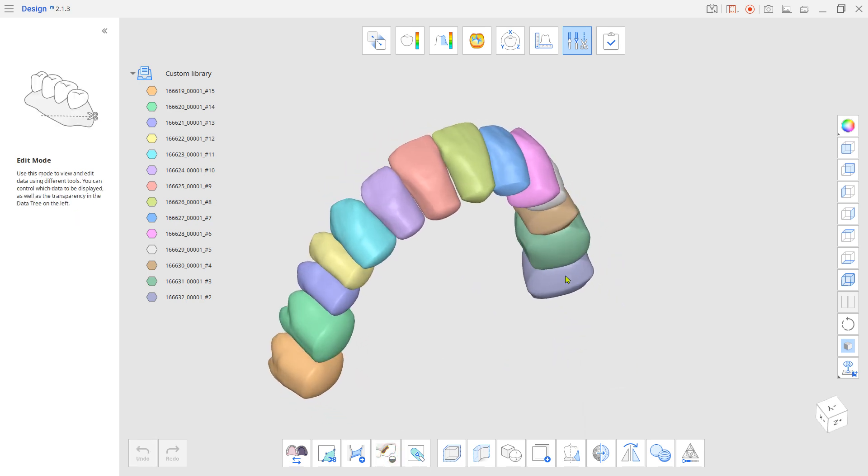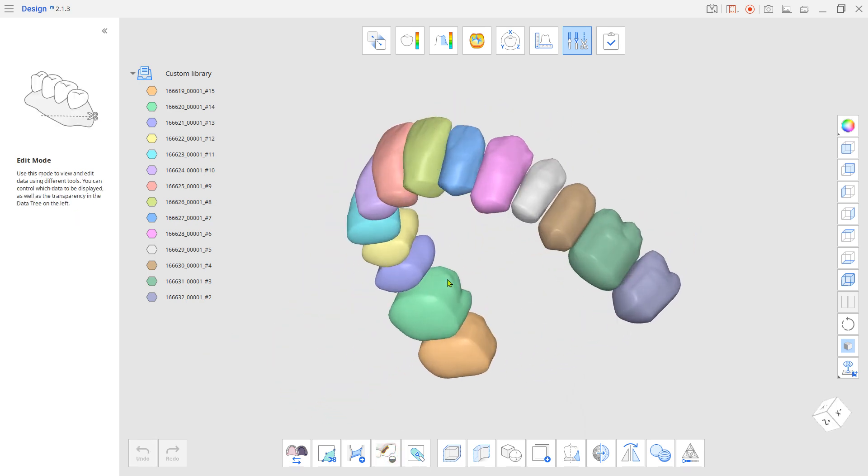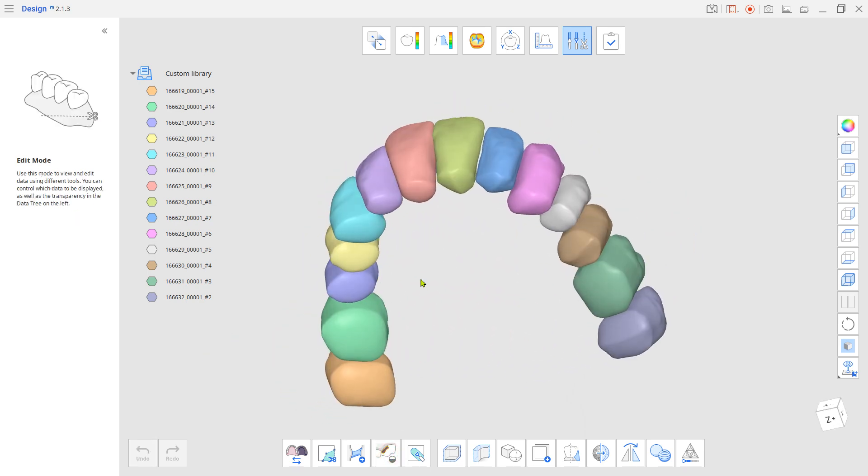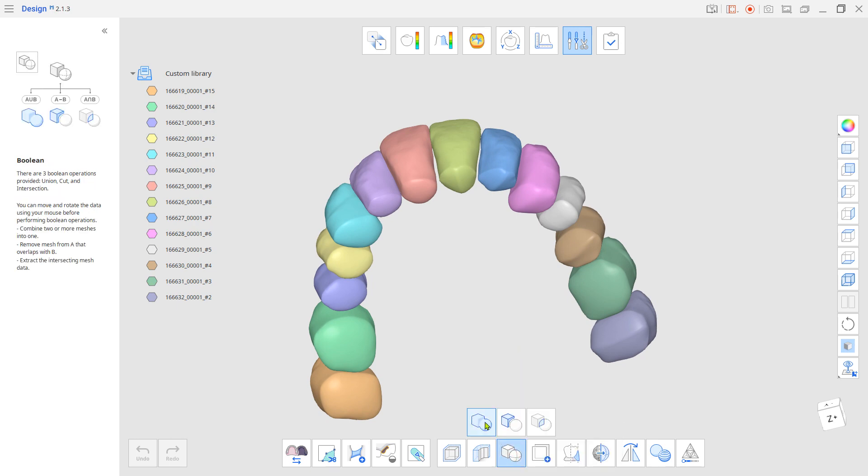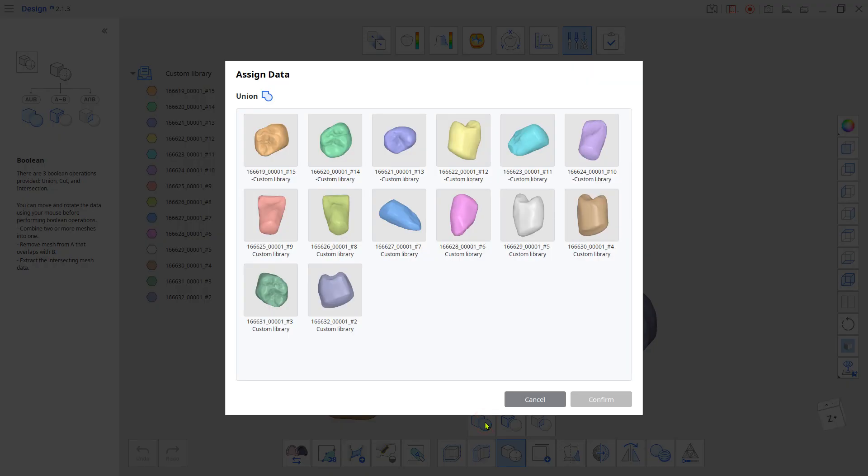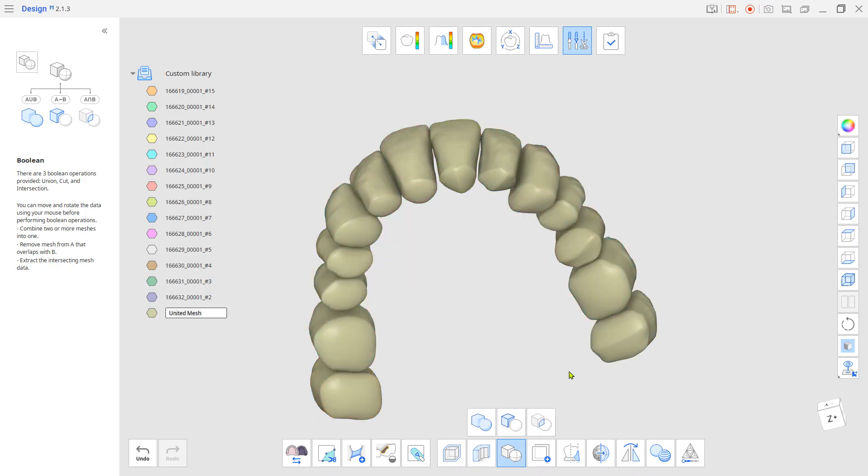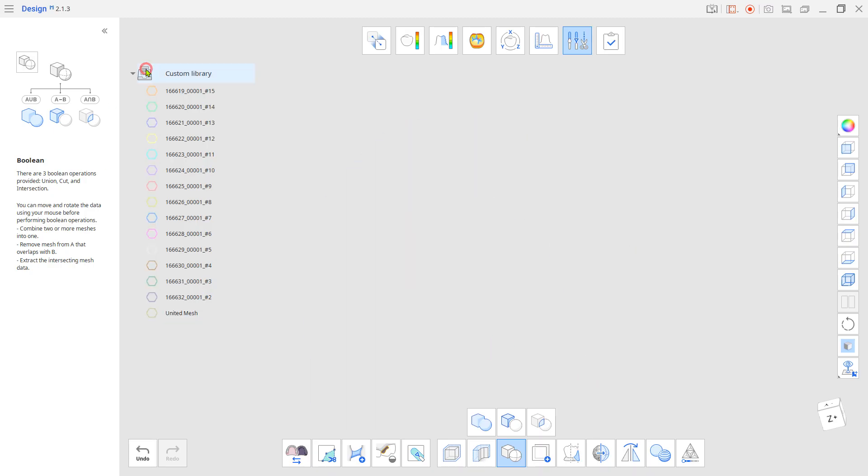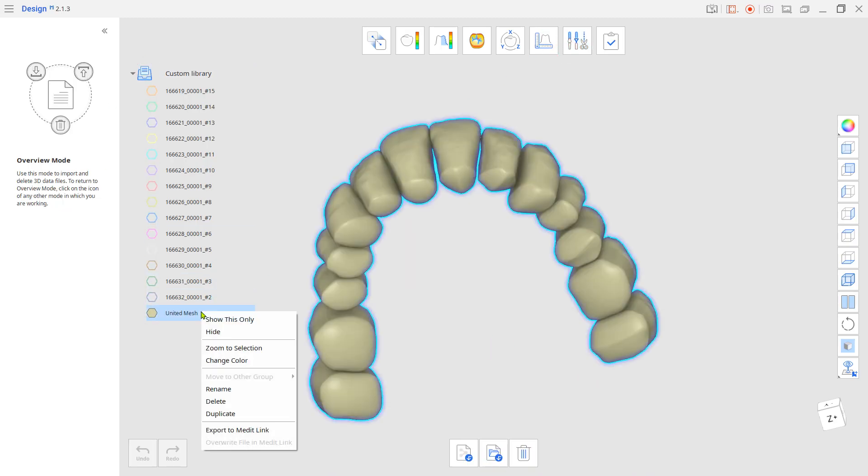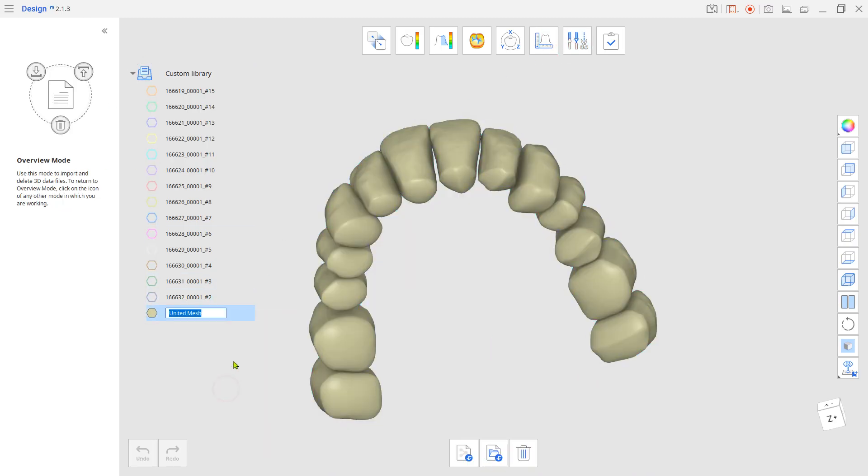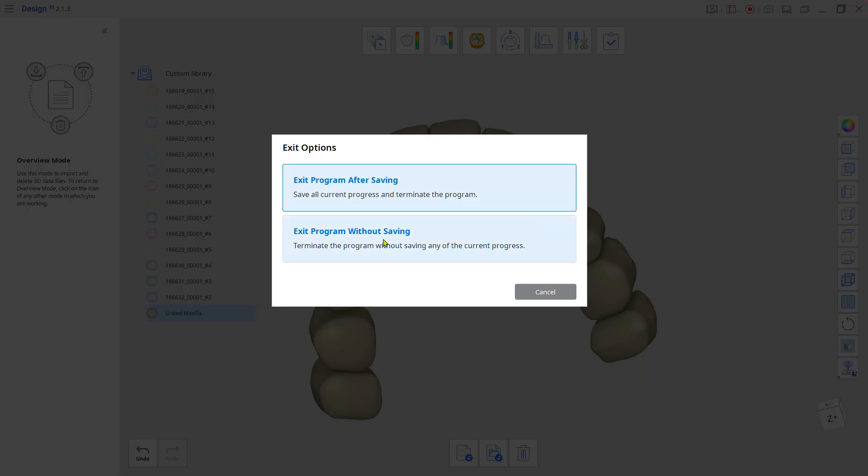Use Boolean Union to merge them into one STL. Now, change the united mesh's name to something you recognize and export it to MeditLink. Exit the design app without saving.